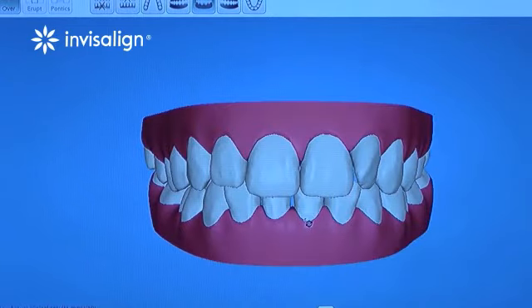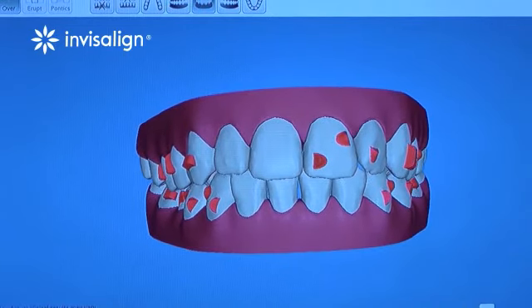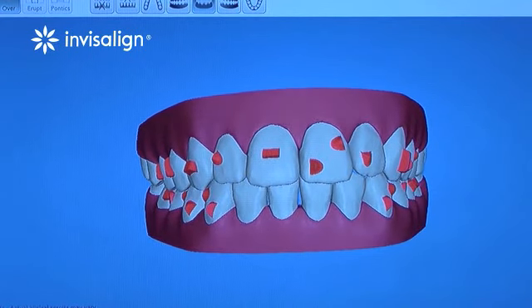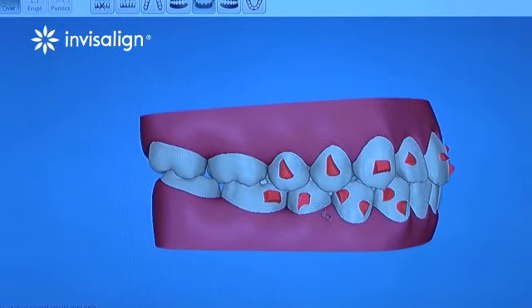These are how your teeth look initially. You'll see the progression of treatment as well as the end result. And you can see the teeth aligning. The bite is starting to open up if you just look at the front. In the end, if I pan to the side, it'll show you how her teeth fit together, and they fit together beautifully on the side.